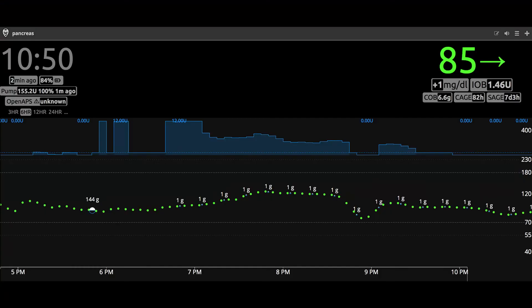Now we're going to test it out — not with one, not with two, but with three pepperoni pizzas. Looking at Nightscout five hours later, you can see the highest it went was 126, with a dip down to 78. If you look to the left you can see the 144-gram initial carb entry, and then at 15-minute intervals there are 1-gram equivalent carb entries that represent the square wave.